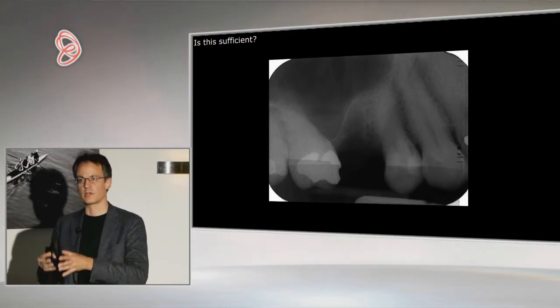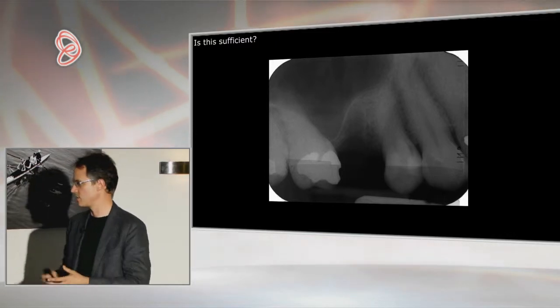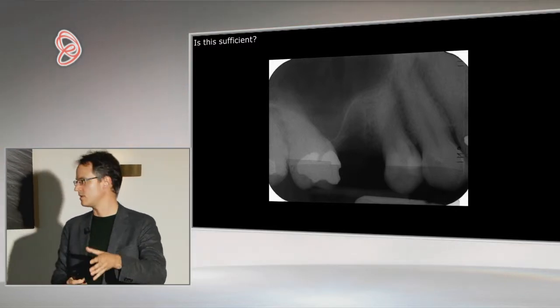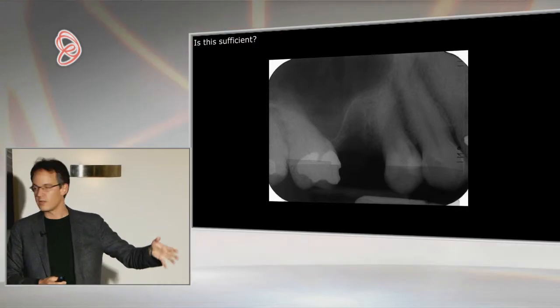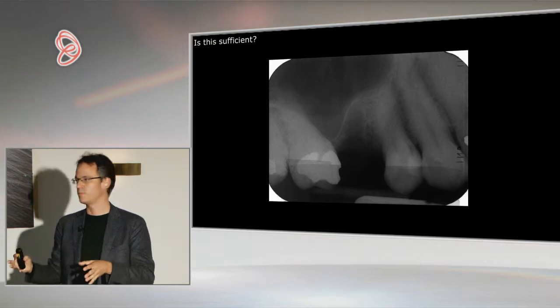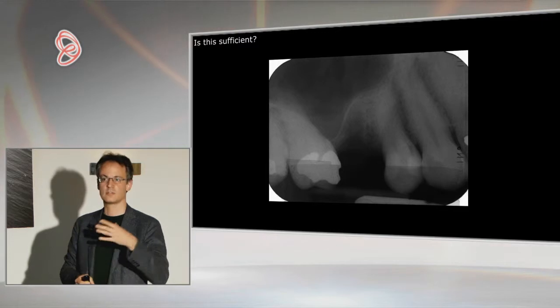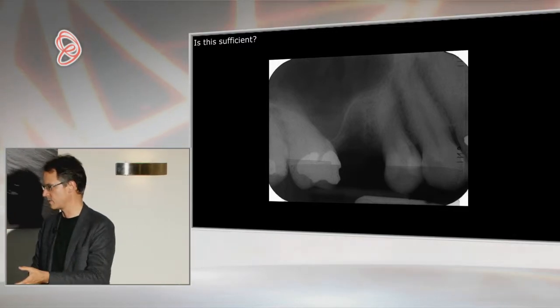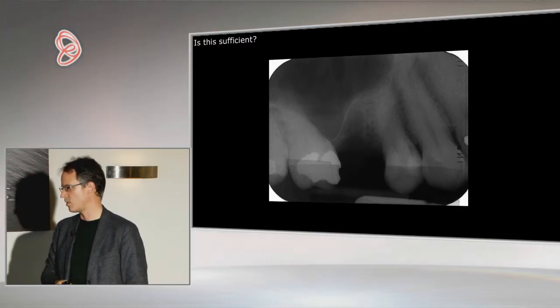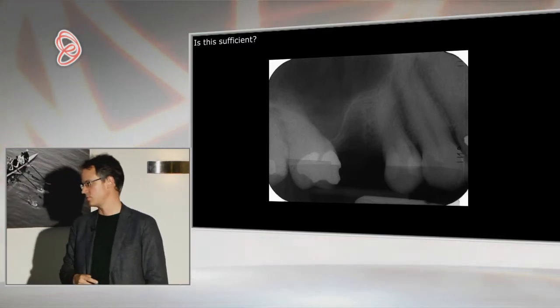It's similar to when you do a crown and you have maybe a wall that fractures and you have to do something else. It's also a complication. So a deviation from your initial plan is to be regarded as a complication. So doing surgery is always better if you have it according to plan, smooth surgery. No stress for me, no stress for the personnel, no stress for the patient. I think we are looking at this more and more. And that's also the goal of all these tools that we now have at hand for planning surgeries.